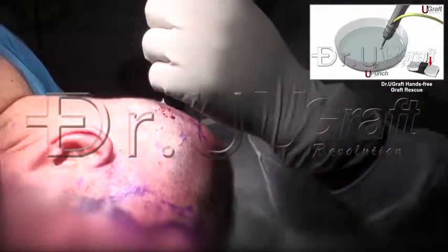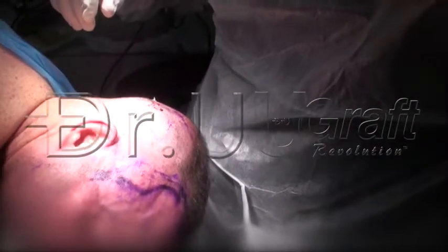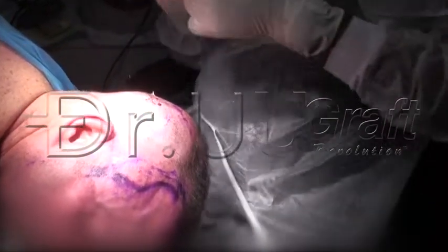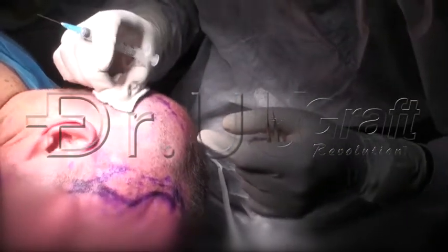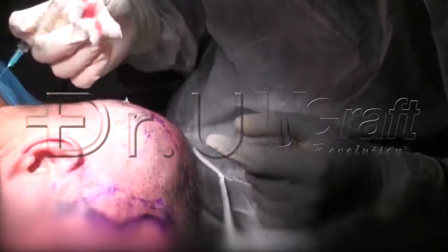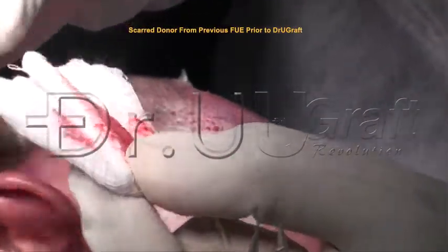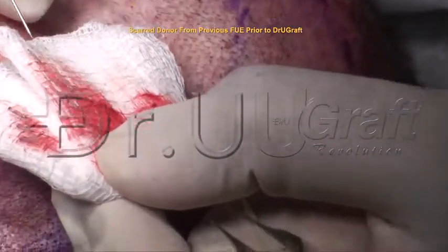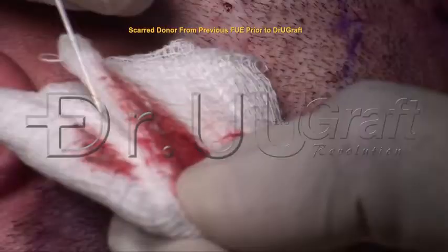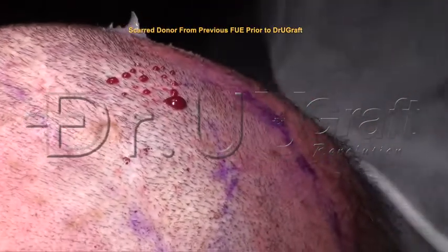All the grafts are intact, and I'm going to pull all those grafts right now. Just from scratching the area, these are all the grafts: one, two, three, four, five, six, seven, eight, nine. How many grafts did we make? Nine grafts. And there are a few outliers.